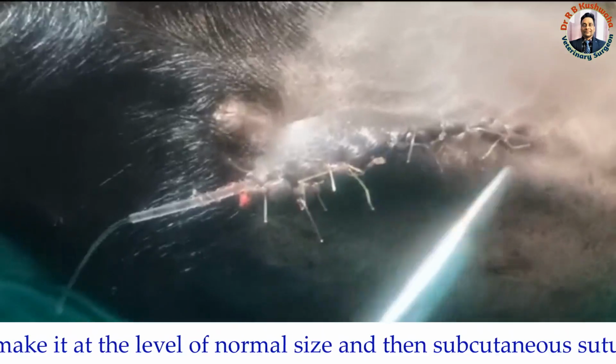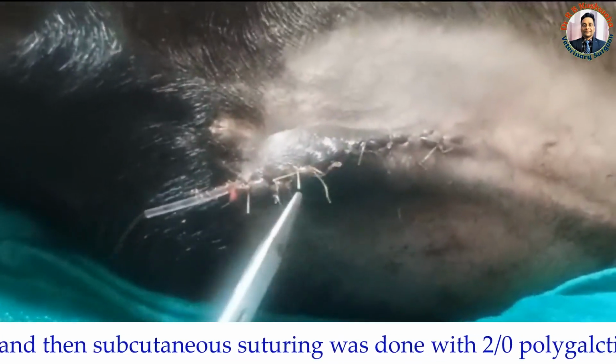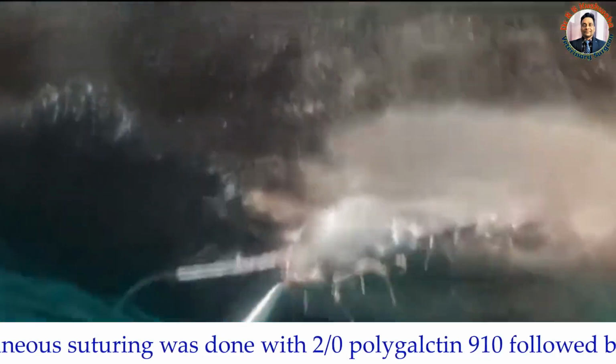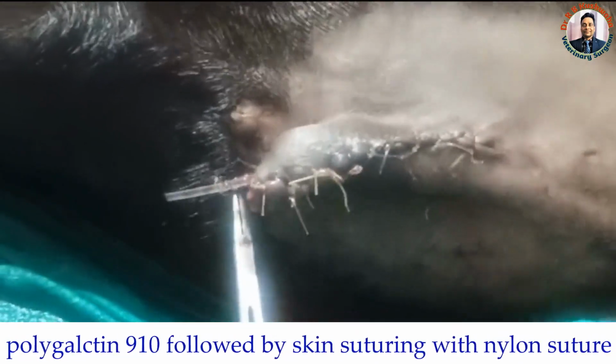So in this way we have repaired the skin. We repaired the skin with nylon using a simple interrupted pattern, and we also fixed this catheter. Now you could see the urine is also coming through the catheter.